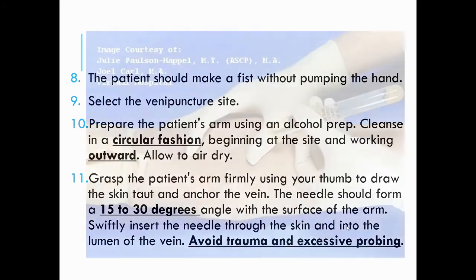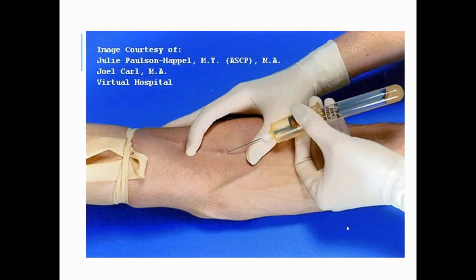Same as before, your angle when collecting from the vein is 15 to 30 degrees. You place the needle in the adapter first, without fully inserting it yet. Then by the time the needle is inserted, that is when you push the tube so that the needle with rubber sleeve punctures it.